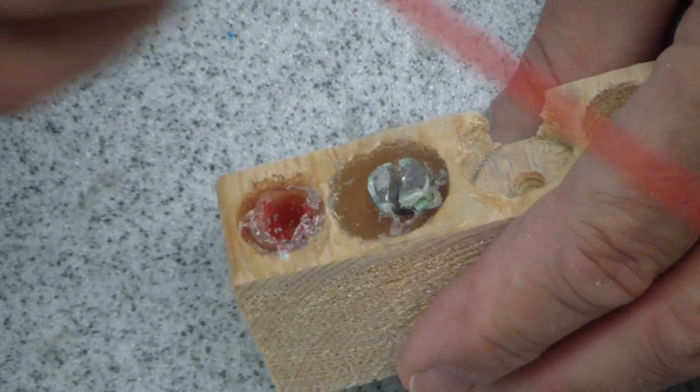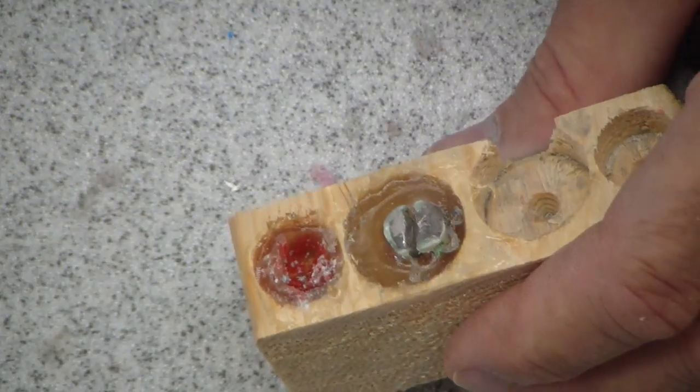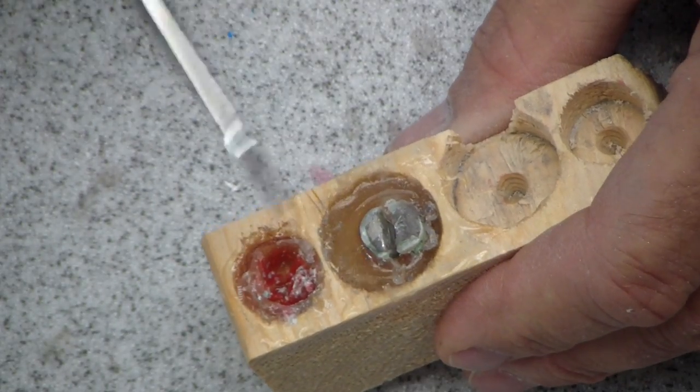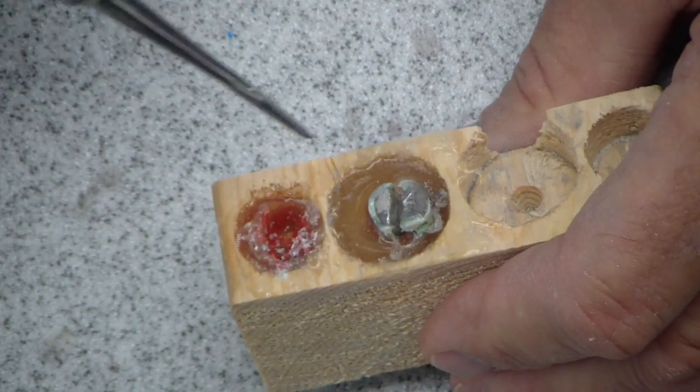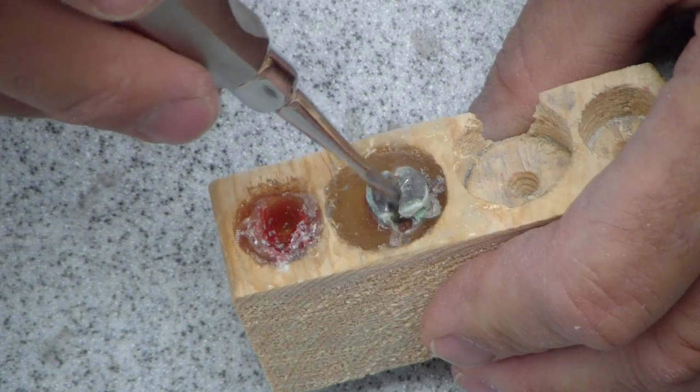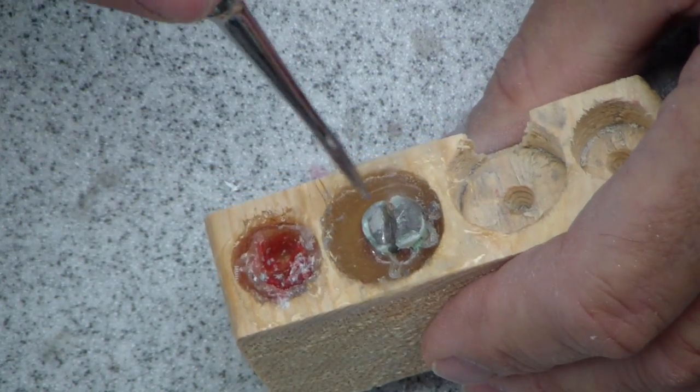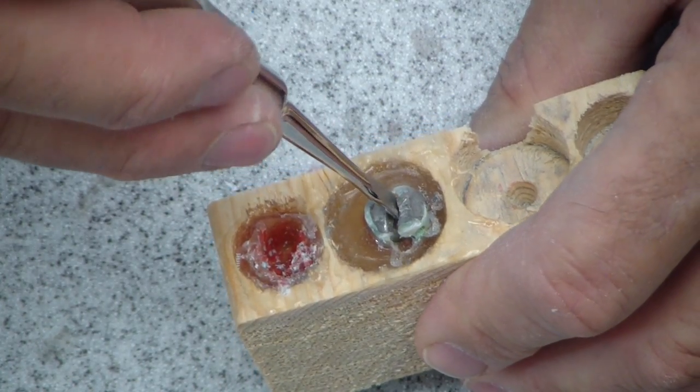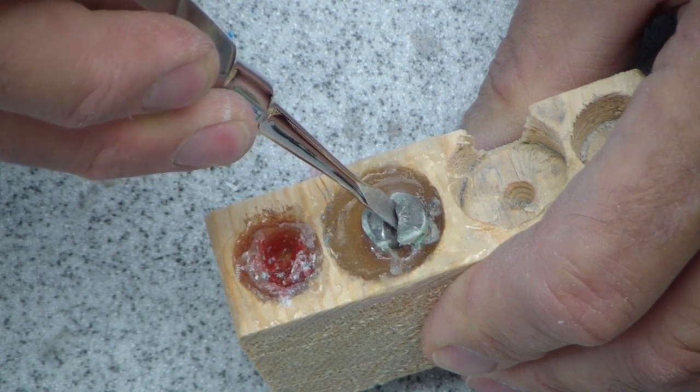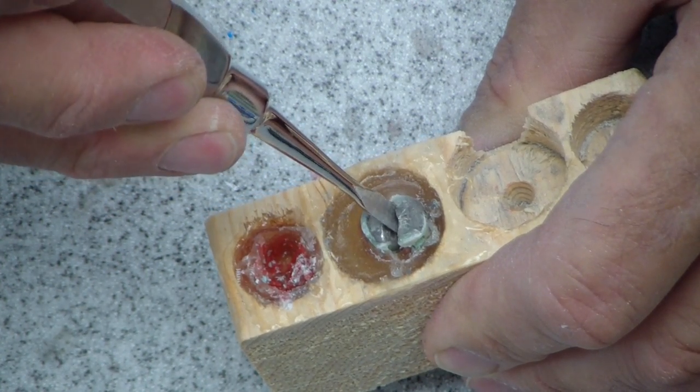I'm going a little bit deeper than I normally would because these are desiccated teeth. Now, again, these are my isolated teeth. I don't have anything I can elevate against on either mesial-distal side. So I've created two teeth. I'm going to elevate one half against the other. And this thing will seat down almost to the floor of the pulp chamber, we hope. Let me do it a little slower. I might hear a little snap. There's a little bit of a snap there.